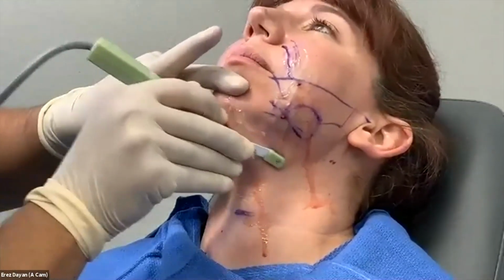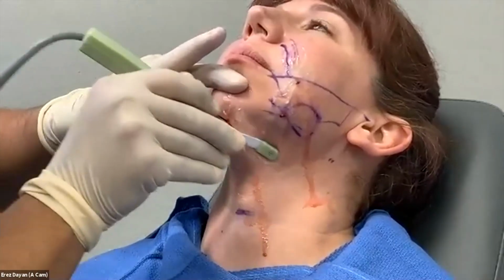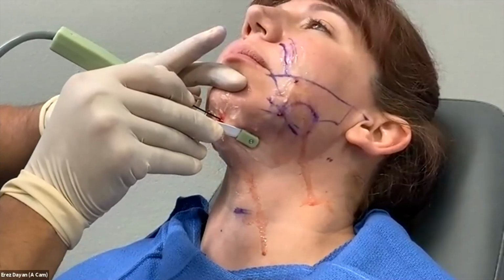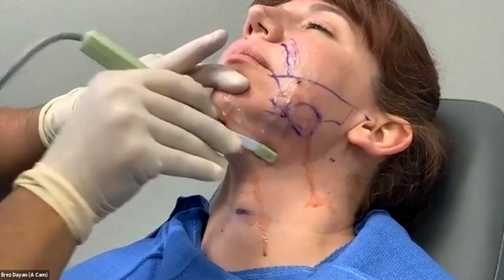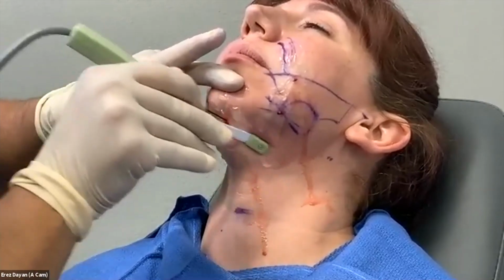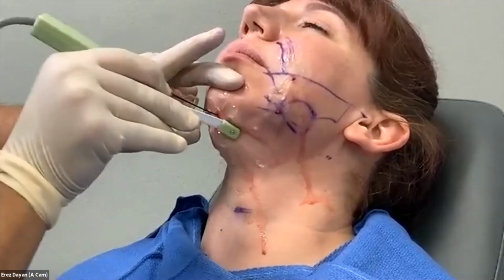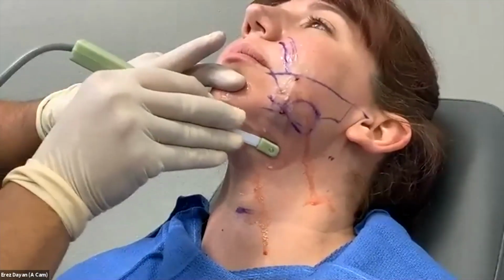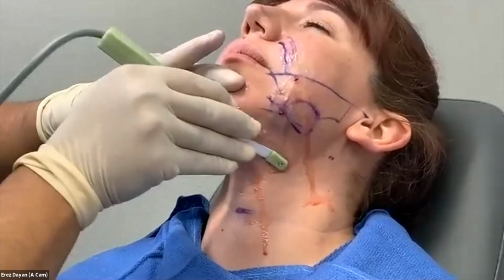And if you need to use your other hand to just kind of stabilize things, you can. You doing all right? So now I hit internal, so now I'm going to go a little faster, get my external. I'm kind of always looking, make sure I don't see any epidermolysis or superficial area. She's falling asleep on me, which is kind of good. Good local.